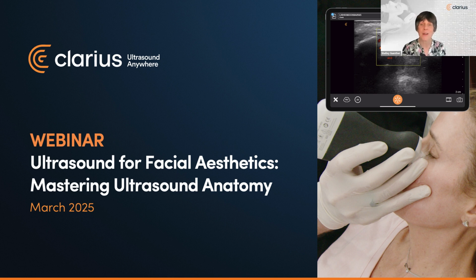Now, this webinar follows our ultrasound basics webinar that we did in January, where a few people asked for more anatomy, so we're delivering. Dr. Weiner will share step-by-step instructions for using wireless ultrasound to identify facial layers, including vascular structures, to help you achieve safer and better outcomes for your patients. And we'll also see some live scanning with the Clarius L20 HD3 following Dr. Weiner's presentation.